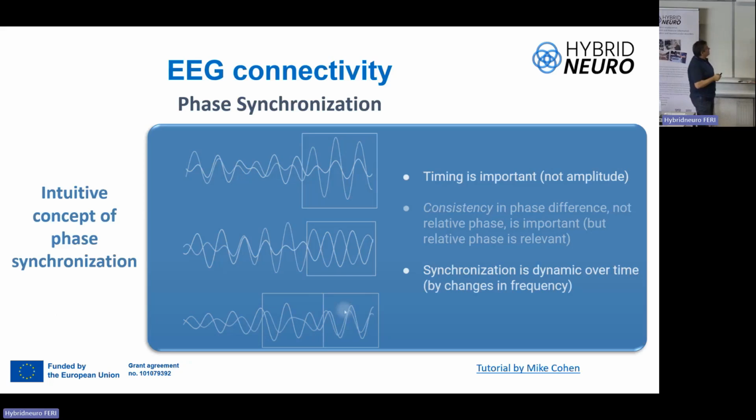We can see here, for example, this phase synchronization in both signals. We can see these oscillating traces. In this case, we have several that are more or less synchronized. Even here, because it's not so important if this is opposite. What is important is the consistency of the phase during the epoch. In this case it is very clear that this is very consistent.